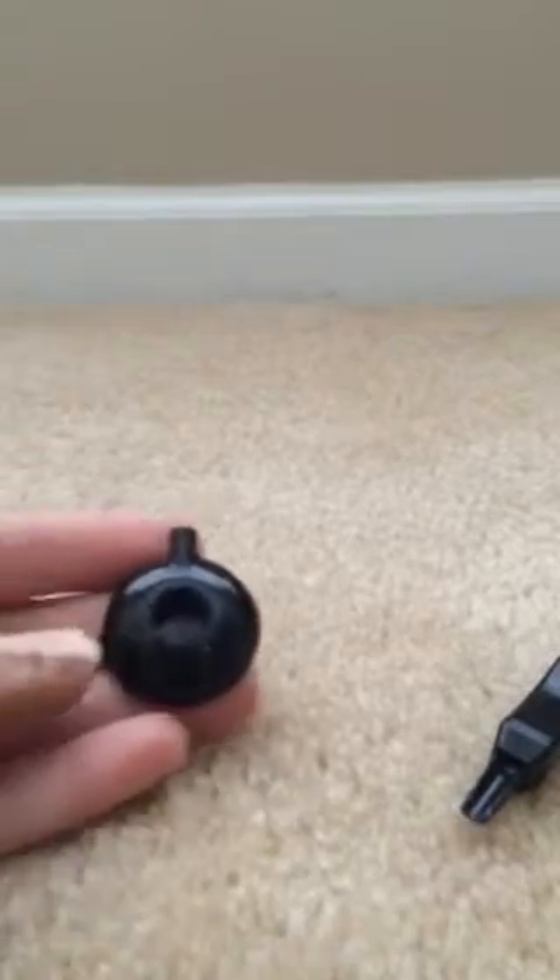Take the little foam out — the magnets fell out. There's only one magnet in there right now, so it's not as strong. Then take your new universal headpiece, and this is how I find out what side the magnet is supposed to be on.